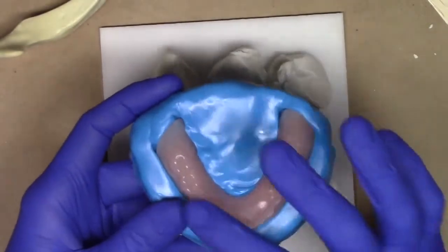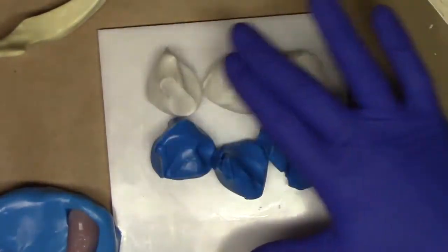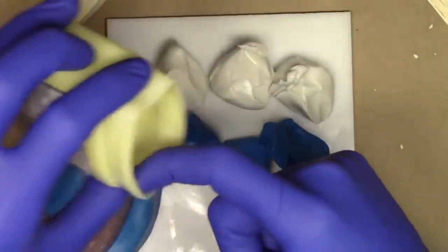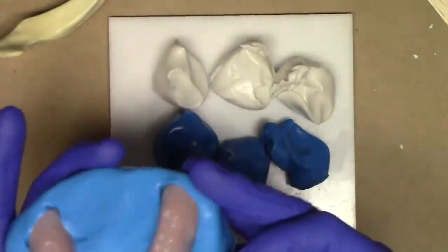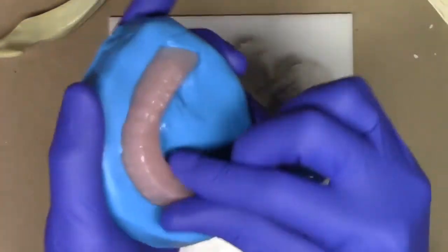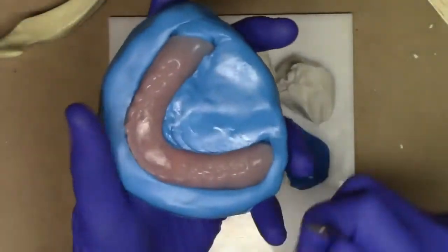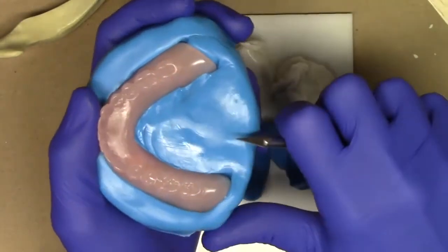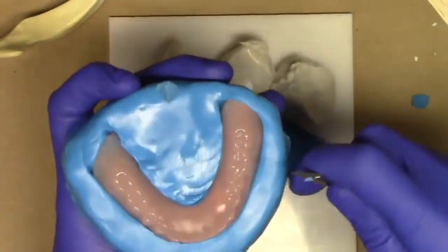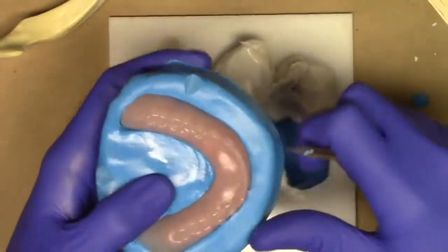So now I have my existing complete denture and my 6 scoops of putty, or 3 catalyst and 3 base. I can take a little bit more of this separating agent and coat my denture. Also, what we need to do is create a couple of little notches. I just use a laboratory knife to create a notch, more or less to give yourself a tripod when you connect all of these together.